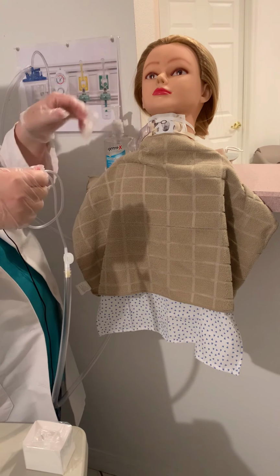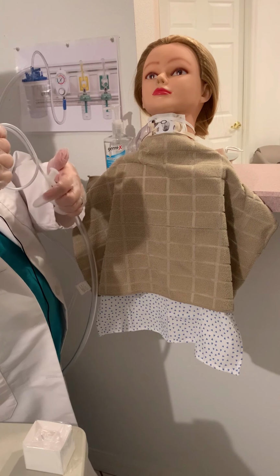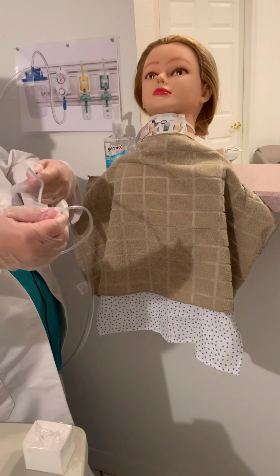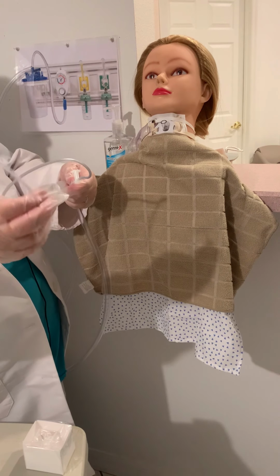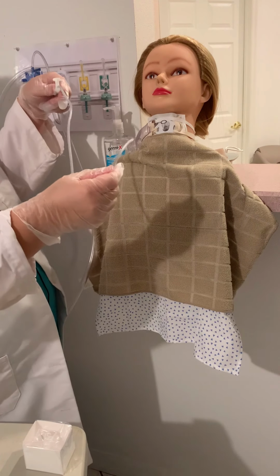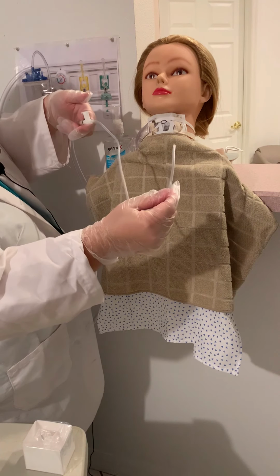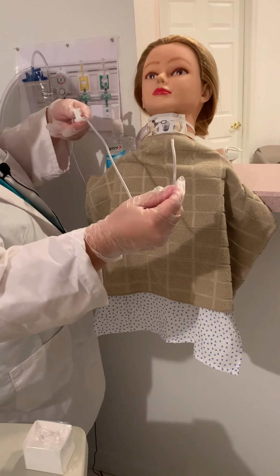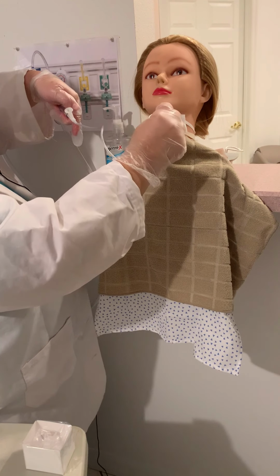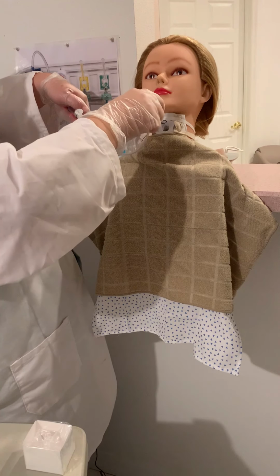If I had an ambu bag, I'd give a couple breaths before I go down, or I just make sure the oxygen was on high so I'm hyperoxygenating. Okay, I'm going to let this uncoil so that I can keep control and see where my tube is. I'm going to keep my thumb ready to go on this section, but it's not going to go on there until after I get in there.